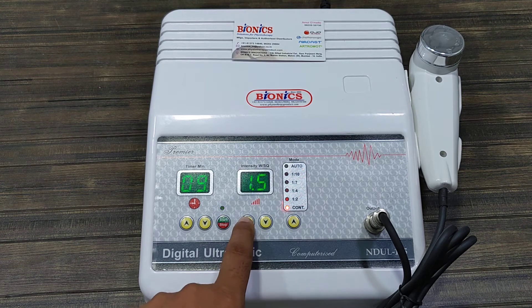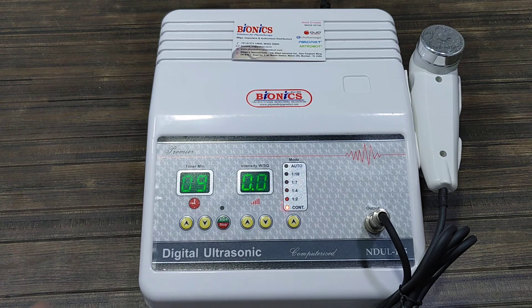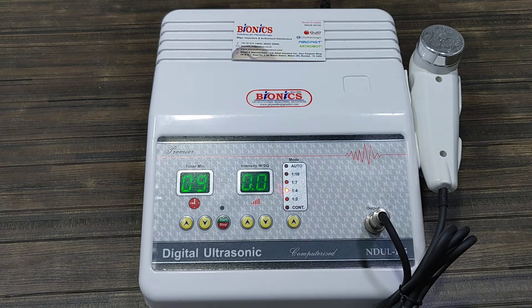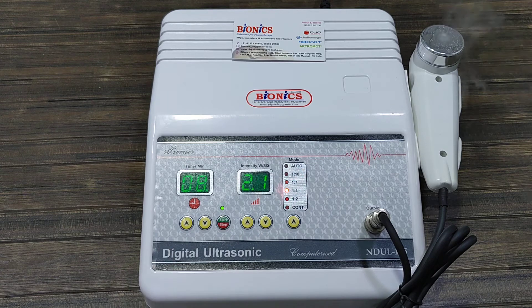Here you can increase the intensity up to 3.5 in continuous mode. Stop, then we can set the 1.4 pulse mode, and again start and increase the intensity. So in the pulse mode you will find out the difference.